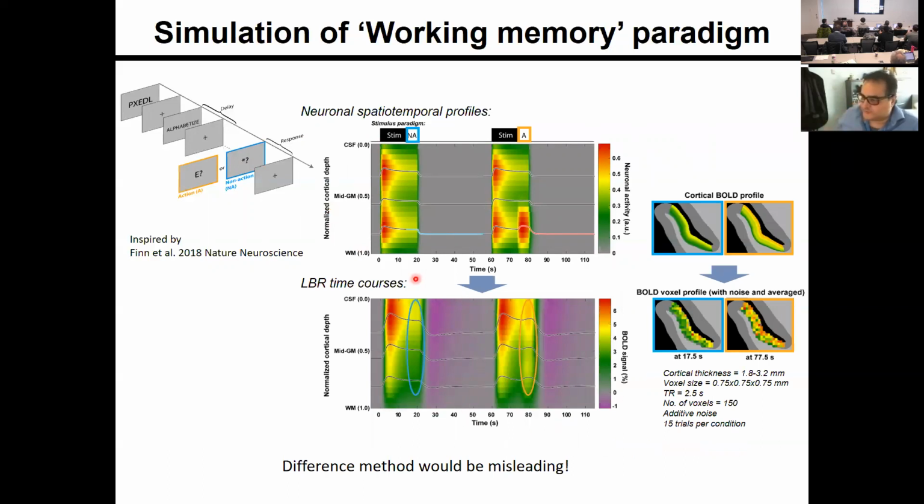So the first observation is, if you look at just this part, here we have 2 peaks. The second, lower peak is almost gone, and we have only a peak in the top. And this peak is even shifted more up. Which means if you would look at just this data, you would never imagine that this data is created by this data.